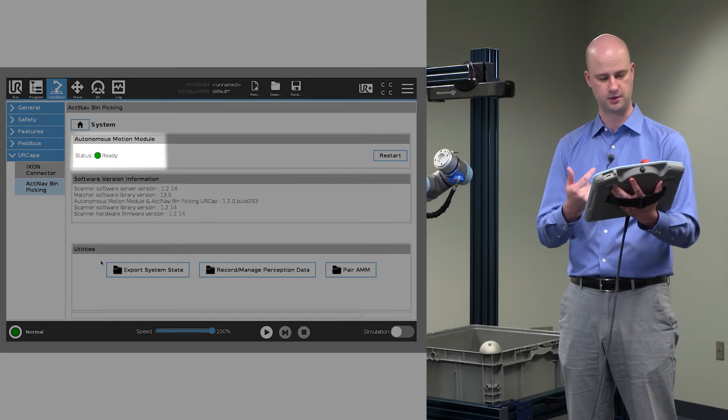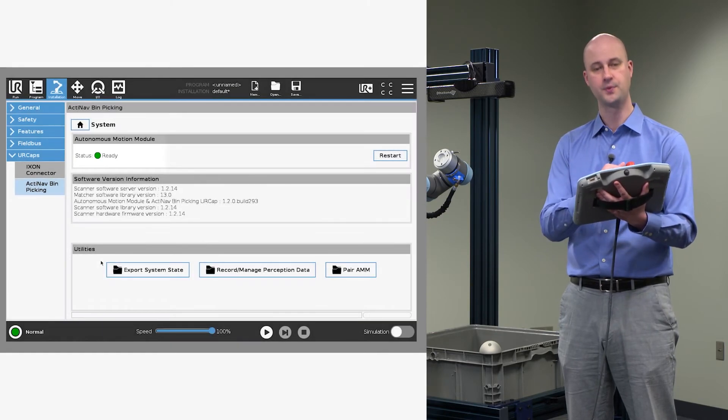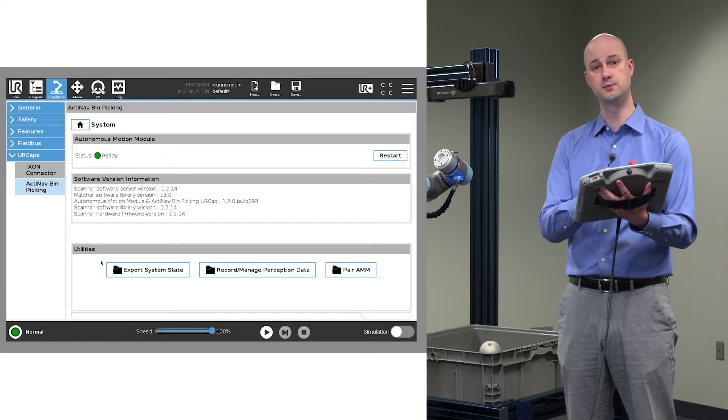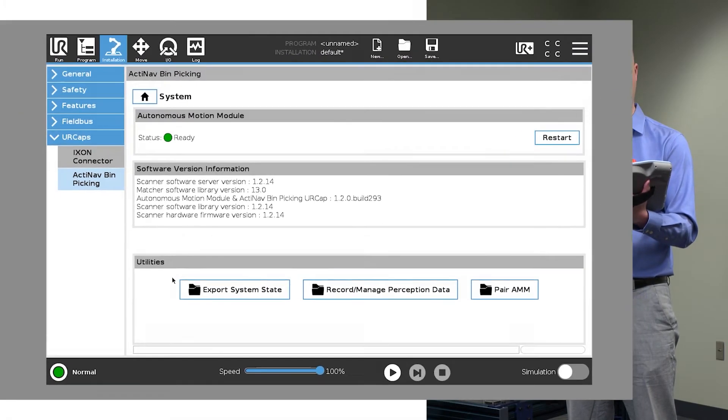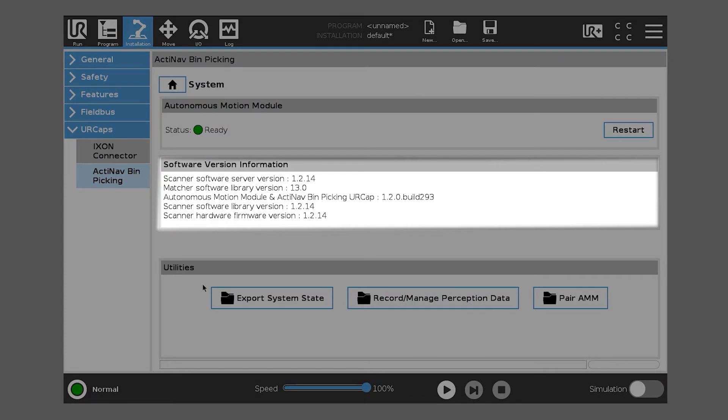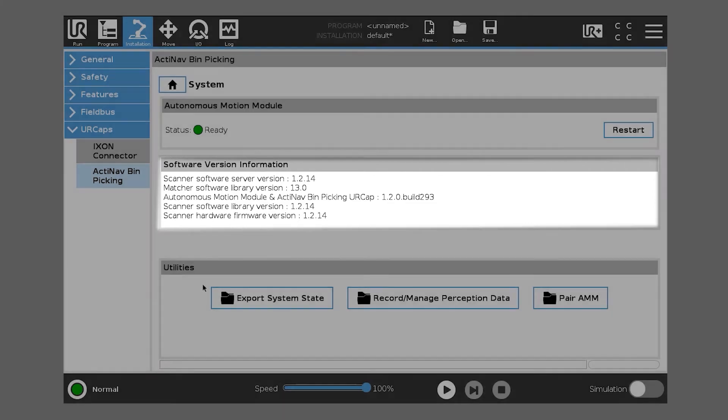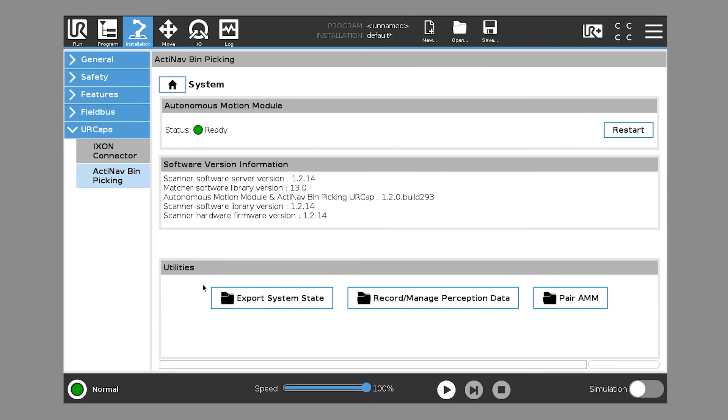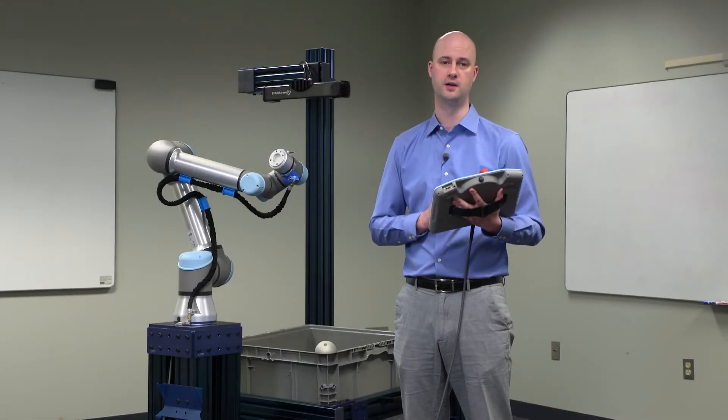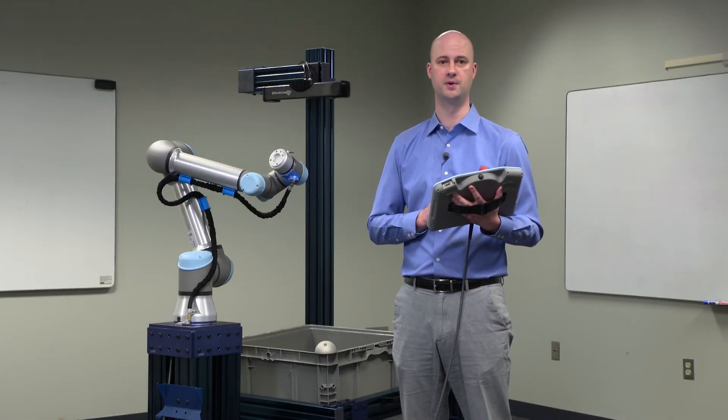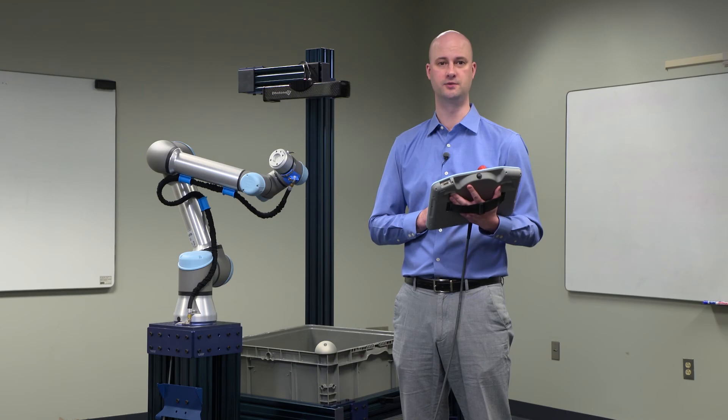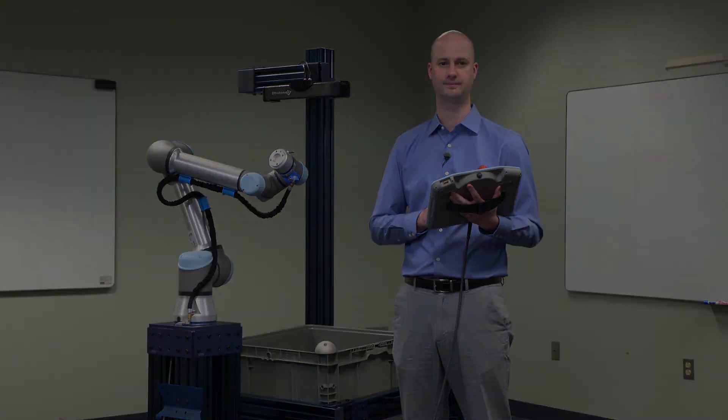You're going to want to make sure that they're talking to each other. You'll also see some software version information that indicates the 3D Scanner software version, as well as the UR CAP version number, as well as the Scanner hardware version number. If all those things are good, then System will show green Ready, and you've now paired your AMM to your E-Series robot.